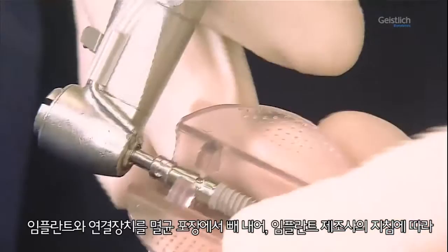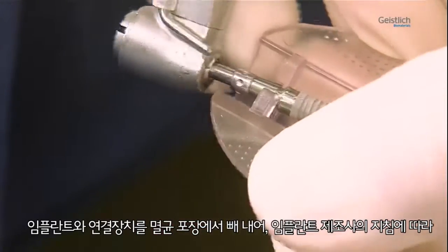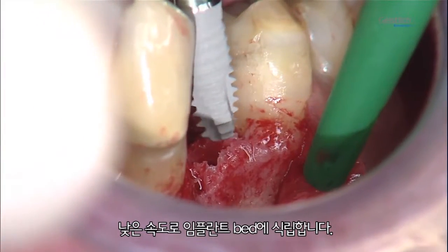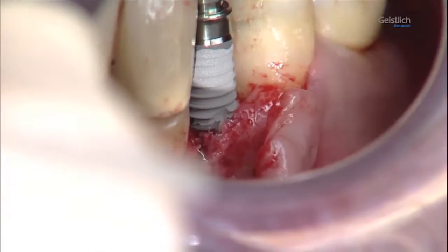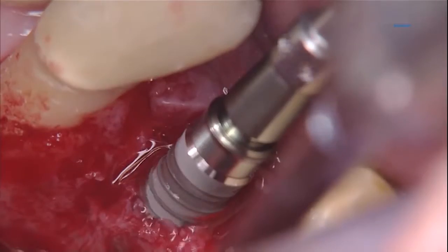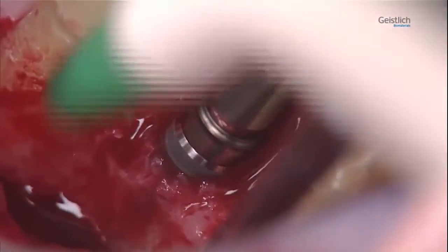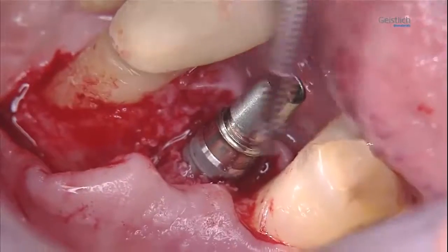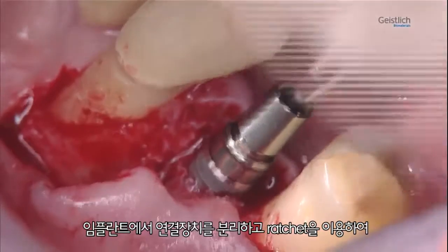The implant and its insertion tool are removed from their sterile packaging and mechanically screwed into the implant bed at low speed, following the implant manufacturer's instructions. We now detach the insertion tool from the implant.